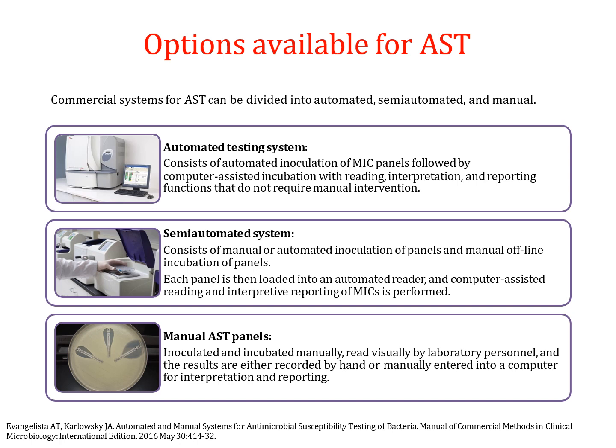Then we also have semi-automated systems, which consist of both manual and automated methods, like panel inoculation and reading, and manual incubation of panels. We have manual methods like E-test or E-strips, inoculated and incubated manually and read visually by lab personnel after incubation.